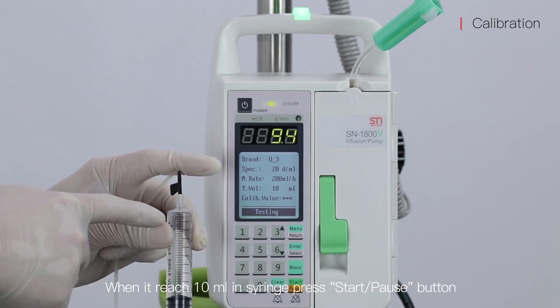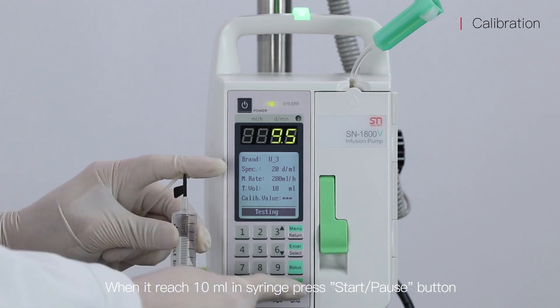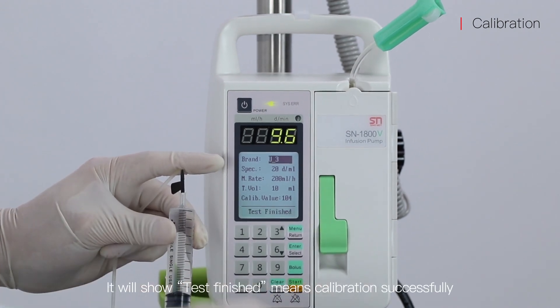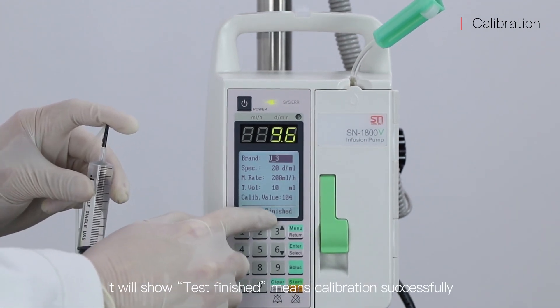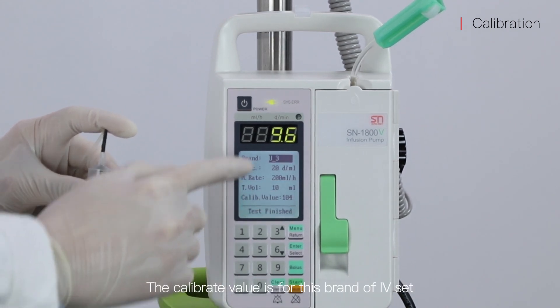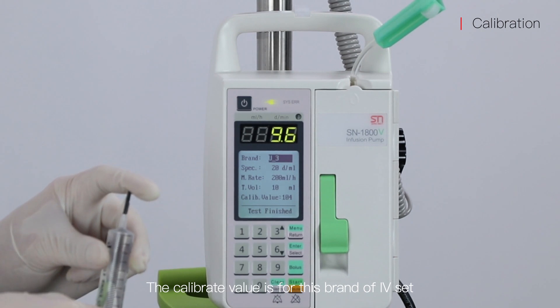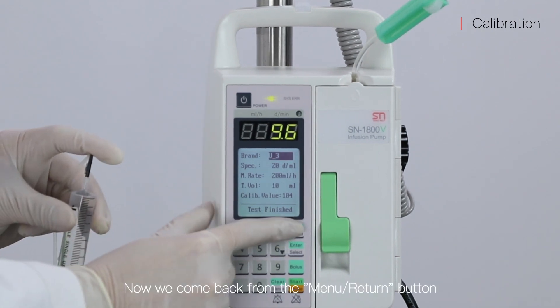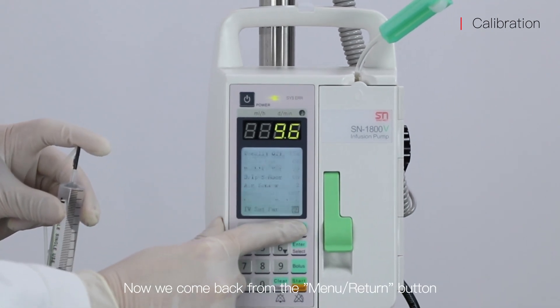When it reaches 10ml in the syringe, press the Start/Pause button. It will show Test Finished, which means calibration was successful. The calibration value is for the brand of IV set. Now we come back from the Menu/Return button.